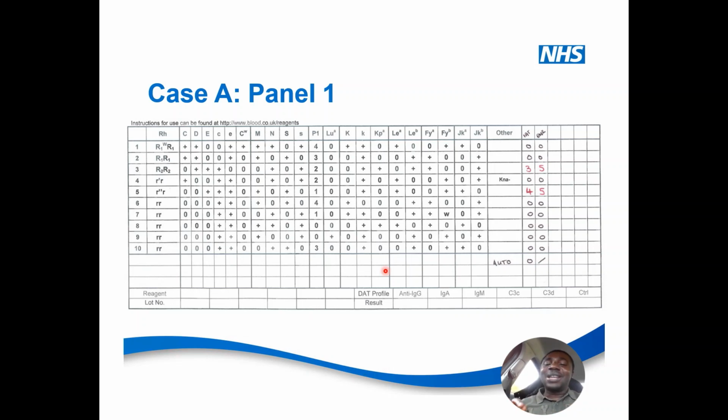So if you go for an interview, they give you something, don't just match it. Just use cancellation method to show that you understand what you are doing, okay? Anyway, so if you use that cancellation method, you're going to see, of course, it matches it, it is big E. This is definitely antibody big E. So if you look at the enzyme, the only thing the enzyme has shown differently, the same results, the same pattern of results. So it's the same thing.